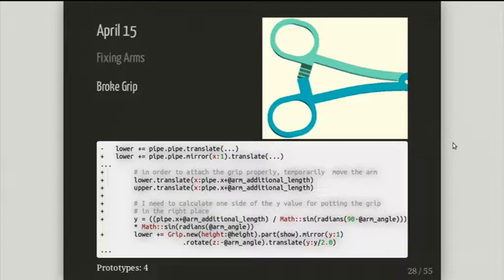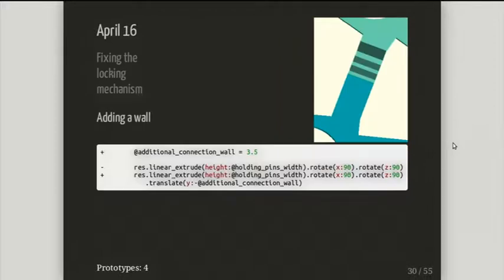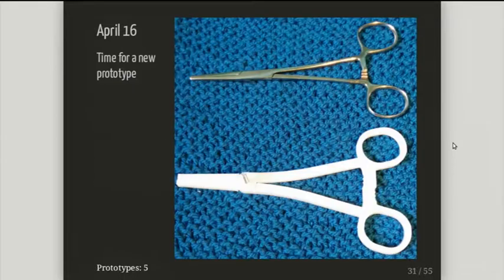Next day — easy fix, wasn't it? Well, there's a wall missing. Easy fix. I just added a piece of wall and basically it was ready for prototyping again. So we're at number five: I had a working hinge, a somewhat working tool head, now we have an arm shape that's in the right shape, and some somewhat working locks.